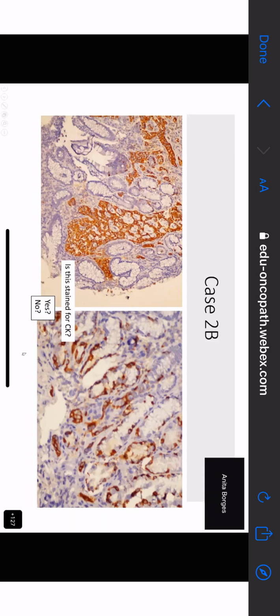So, Limpy, you were right for the wrong reasons. Okay? You felt that the tumor, and it's obvious that there is tumor over here, has been stained, and this tumor is a neuroendocrine tumor, and neuroendocrine tumors do not stain for cytokeratin. My dear Limpy, they do stain for cytokeratin. Has anybody answered in the chat box, Bonita? What did most people say? There is a mixed answer, ma'am. Some have said yes and some have said no.